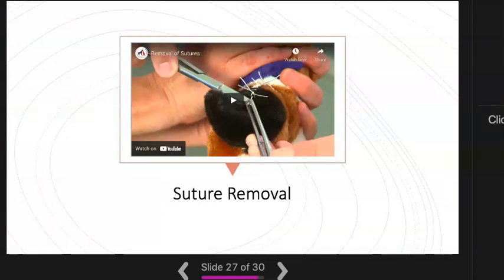If you're employed by a veterinary hospital or practice as a veterinary assistant, it may be one of your jobs to remove sutures in those patients that return postoperatively. It is important to understand how suture material is laced through the skin. We will have an opportunity in lab to look at the different suture patterns and engage in suture removal on a model animal.